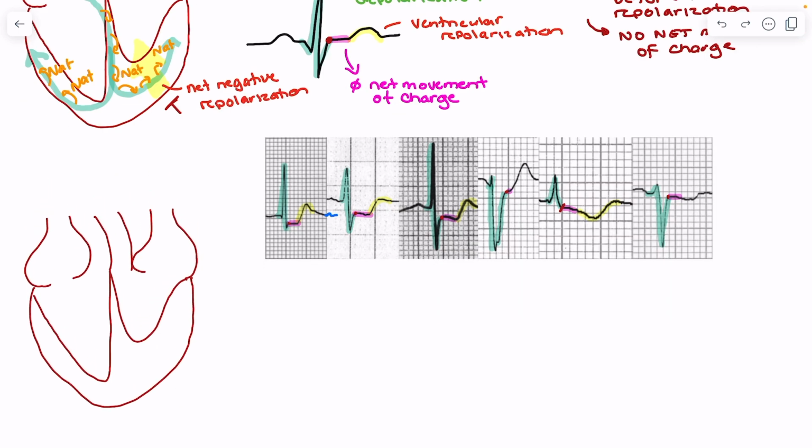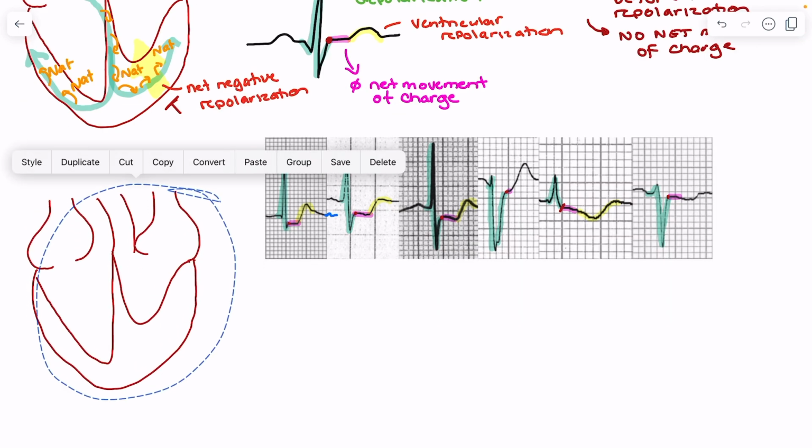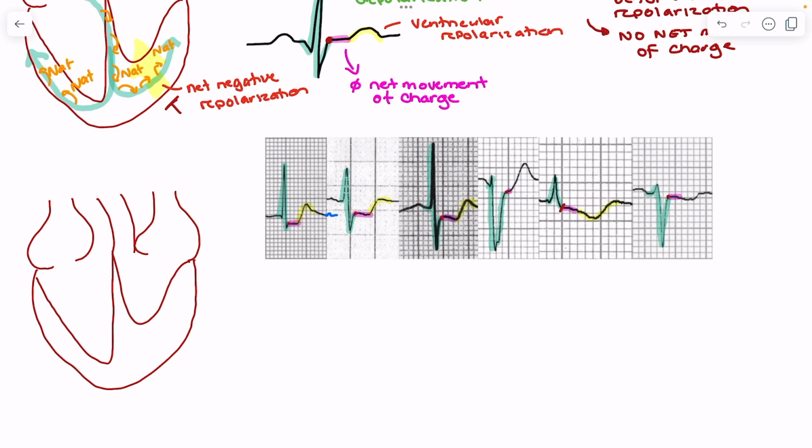What we'll do now is take a look at a heart that is having infarction. So someone who's having a transmural infarction. I can link here to why we see changes in our ECG in transmural infarction, but we'll use this time to look at, again, finding the J point in ST elevation MI and why or how that's occurring as it compares to the J point.